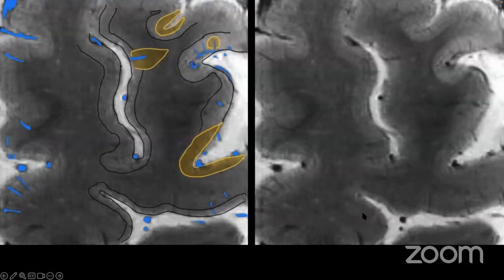So on your right hand side is a normal high field scanning of the cerebral cortex, and that's a zoom in to imagine what's happening here. So again, as we have agreed, all the lesions come around the central vein. So this is one type of the 4 types of cortical lesions. Can you see these tiny hypointensities in these lines, and the bigger subpial blood vessel here? I've labeled them in blue so you are able to appreciate them.